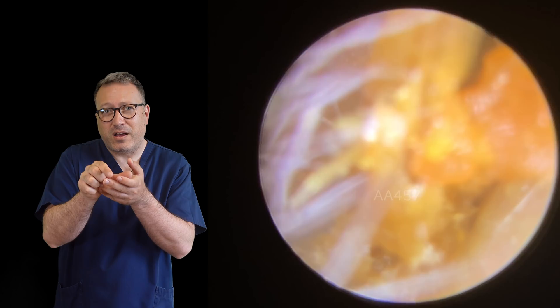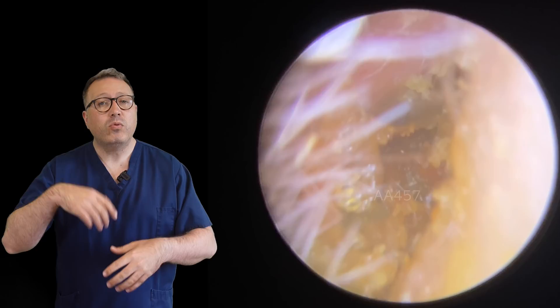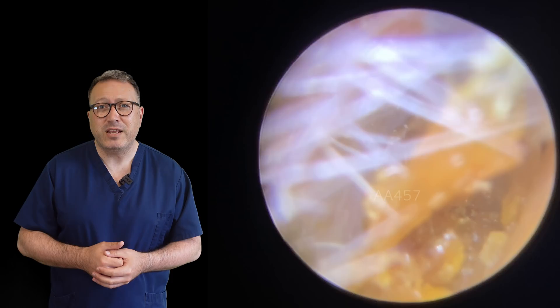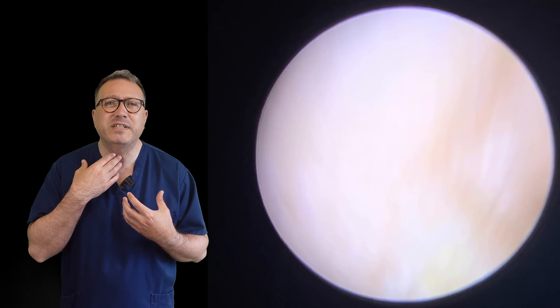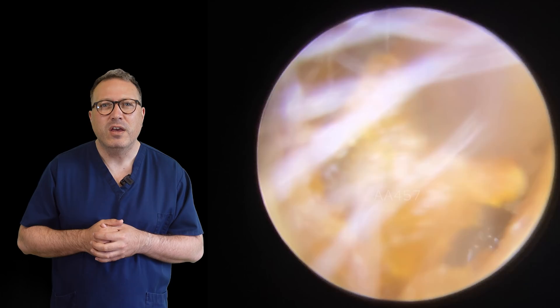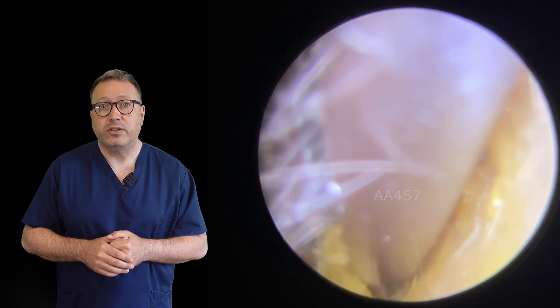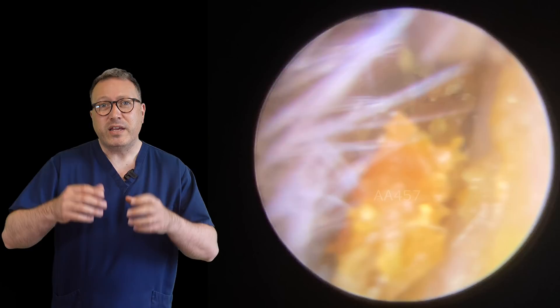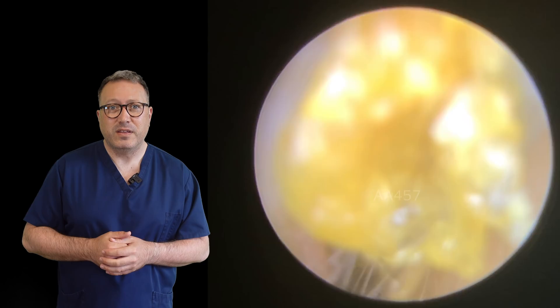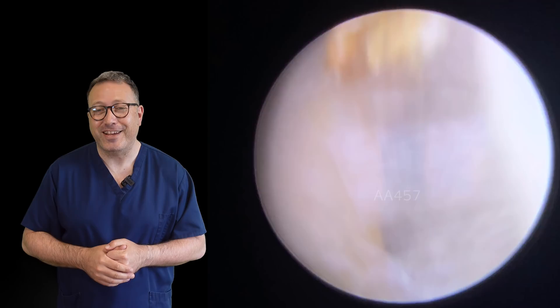Slowly starting to pull this away, going back in with the forceps again, drawing this down the canal. We're always checking in with our patient at this point as well, making sure they're okay and not uncomfortable. The patient did start to experience a little bit of what we call the Arnold's reflex, which is where you get a little bit of a tickle at the back of your throat, just because we were working and pulling the skin away from the canal walls. You can see as we lift how far back that strip of skin goes. We've clamped onto that piece of skin and we're drawing it down. So you can see we're constantly taking away these little tiny pieces all the time — it does collect together to be quite a big amount at the end.